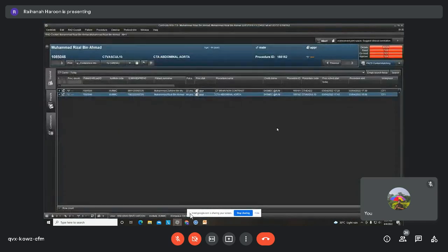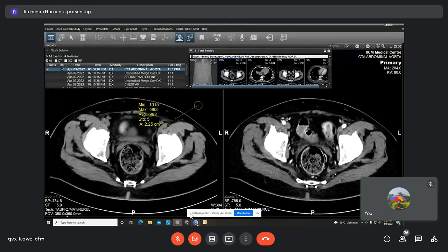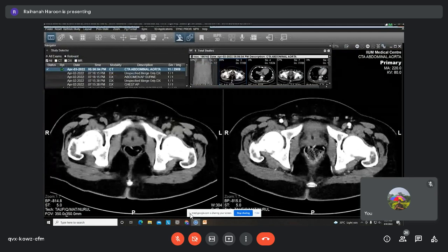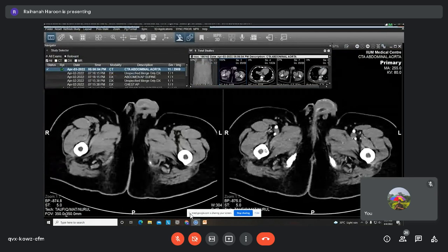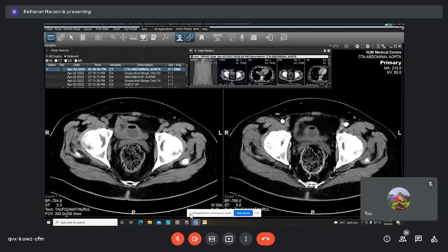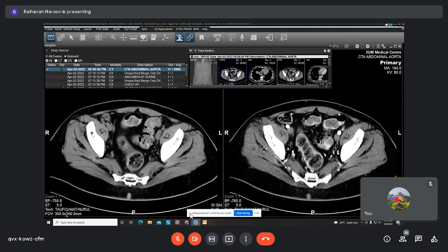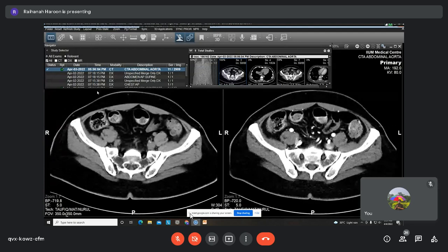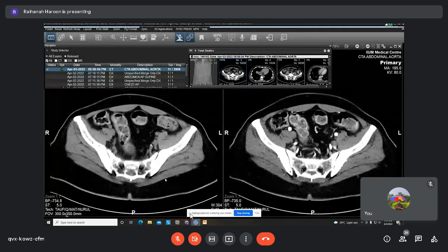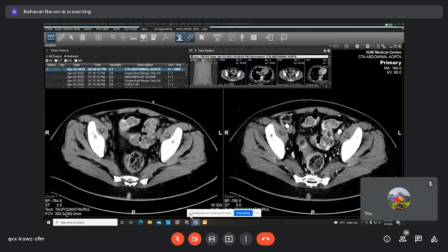And you know, this is what we call workstation. Okay, this is how we report day to day. When you come to the department, you can always ask some of the MOs, or even during class with the lecturers, you can ask them to show you certain things, because some of this cross-sectional image, the axial view, will come out during your OSCE. So you can always ask to have a look at them.